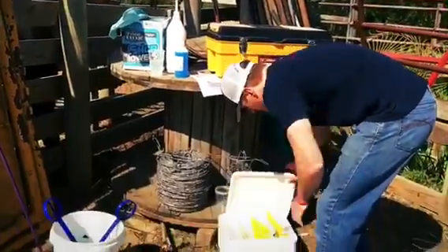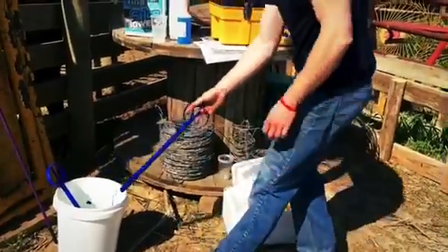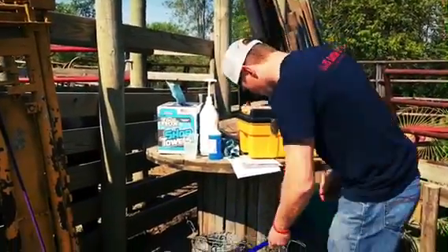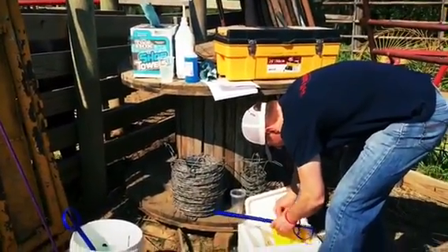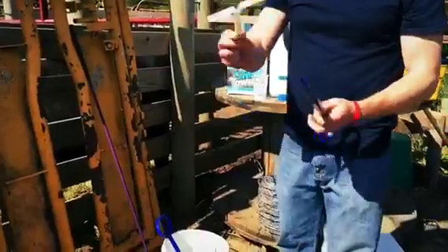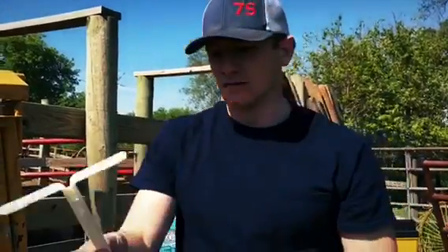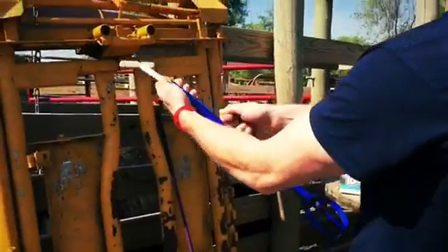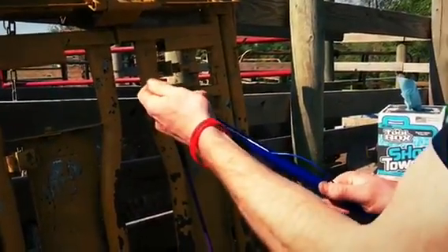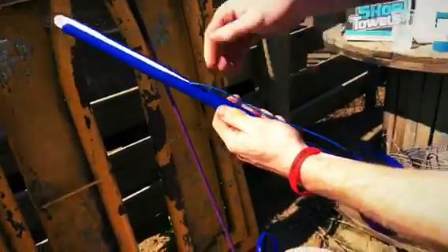To start out, I pull my applicator out of the disinfectant and wipe it down. Then I pull one CIDR out of the box. You want the tail head up — this is the tail — you put it into the top, pull it down, shut the wings, and now you're loaded. Tail up, wings down.